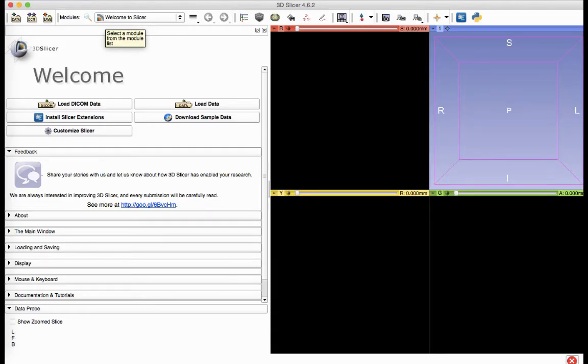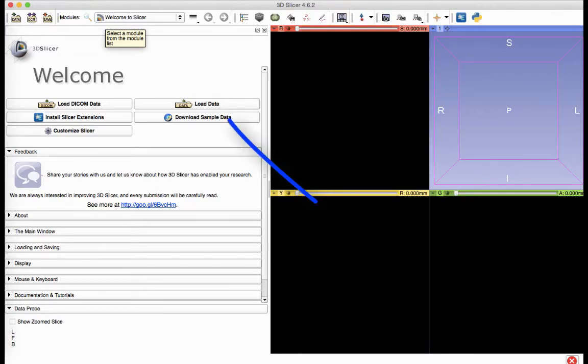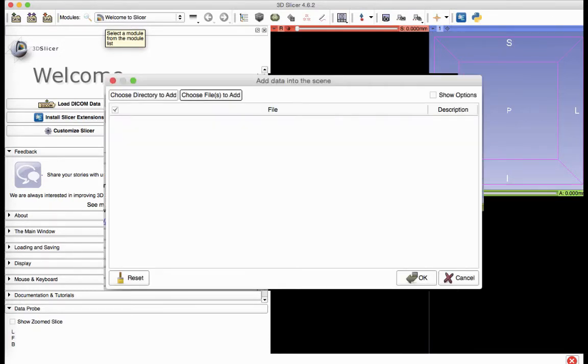After installing and opening the 3D Slicer program, the first step in generating an STL file is to load the NRRD file from our website into Slicer. This is done by selecting the Load Data button. When the Add Data into the Scene box appears, click the Choose Files to Add button.